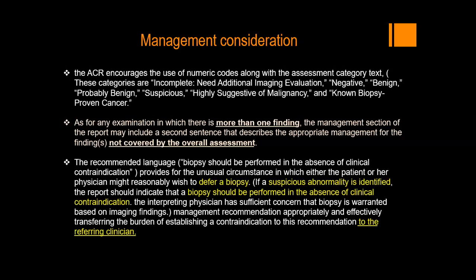So we have to put this sentence, as the interpreting physician has sufficient concern that the biopsy is warranted based on the imaging findings. The management recommendation appropriately and effectively transfers the burden of establishing a contraindication to the referring physician. So the radiologist is free.